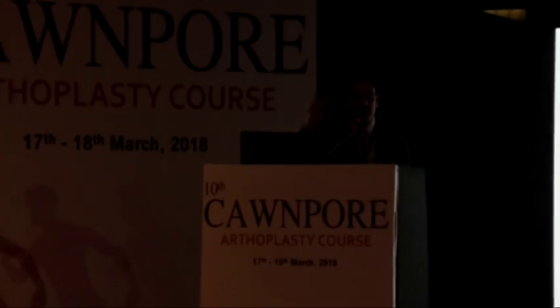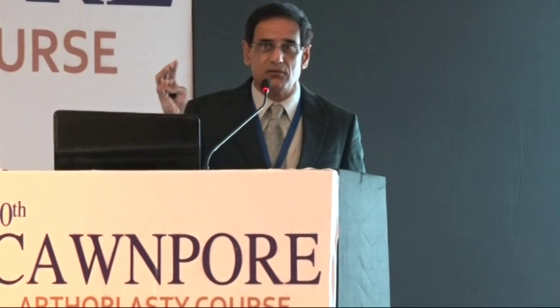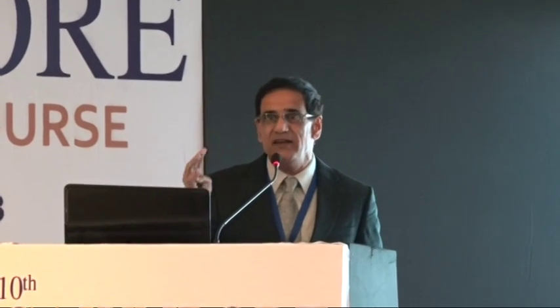If you do not take varus and valgus stress X-rays, you should not proceed with selecting a patient. It's just a rule. You just have to accept that. Unless and until you do a varus and valgus stress X-ray, you should not proceed with Oxford replacement. And this has been validated countless number of times.